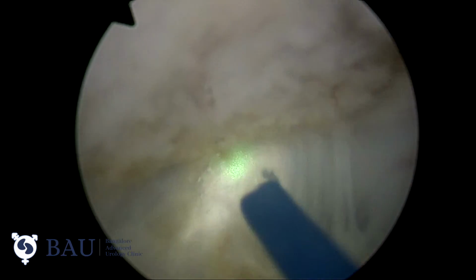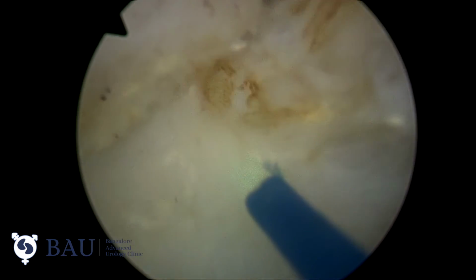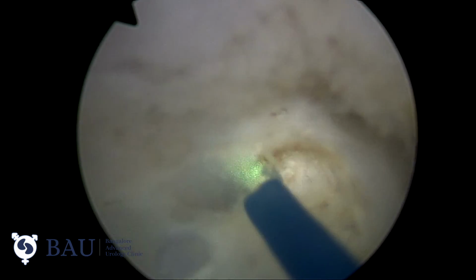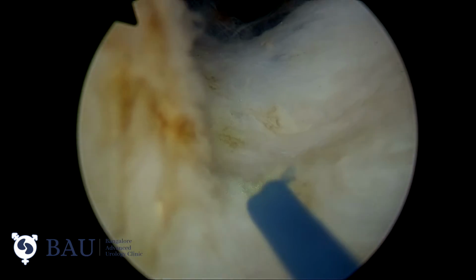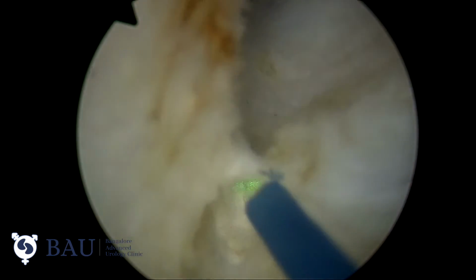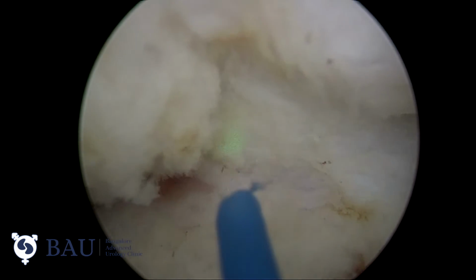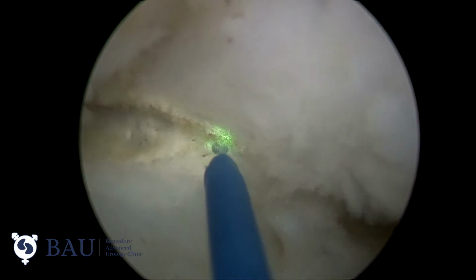Now we can push the prostatic lobe inside the bladder. That will help us for better dissection. And since we already know the lateral limits, chances of undermining or injuring the ureteric orifice become lesser. During this dissection, we can distend the bladder a little bit, close the outlet partially, and distend the bladder. That will push the ureteric orifice a little bit inside, and then we can finish the dissection.